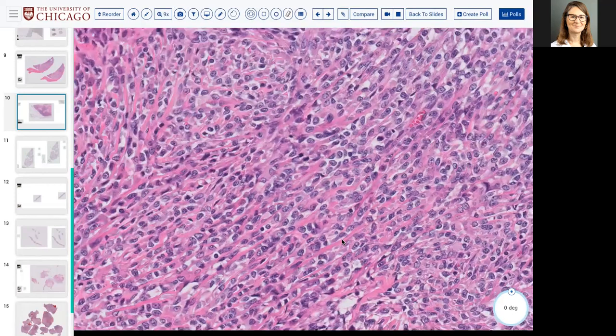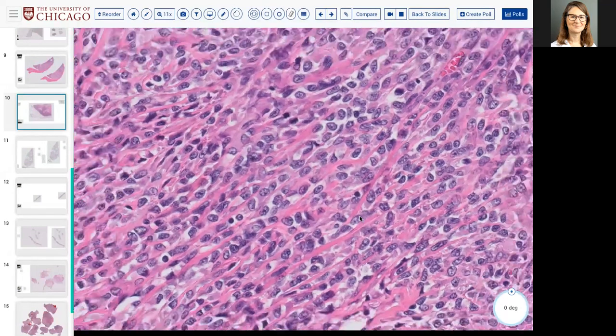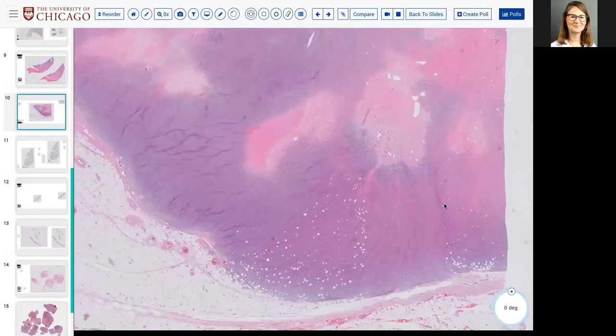Now, one sarcoma type to another sarcoma type, thankfully, is not as big of a deal as recognizing this as a sarcoma and having the patient get treated appropriately. But a pitfall for this is mistaking this as osteoid. And so, anything that is remotely suspicious, just do the EMA and the MUC4, and you'll get hopefully the right answer. Does that make sense?